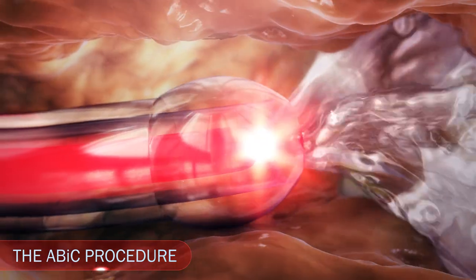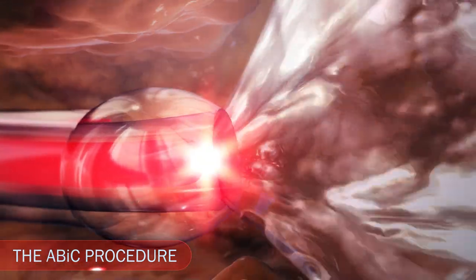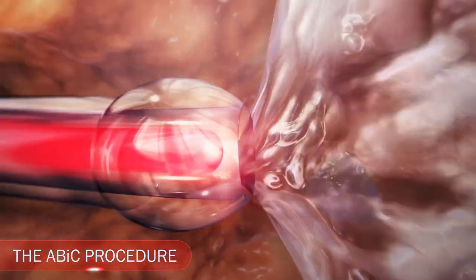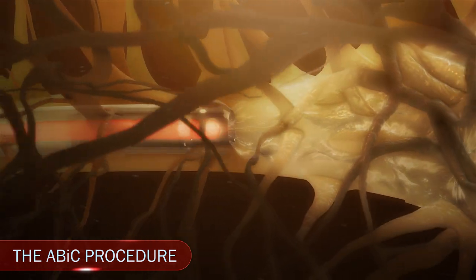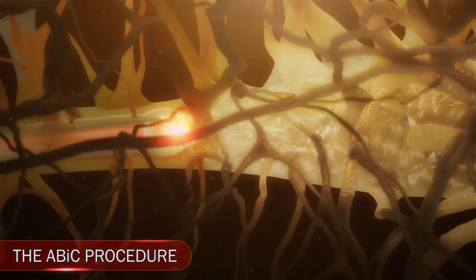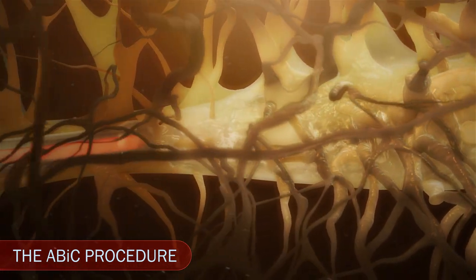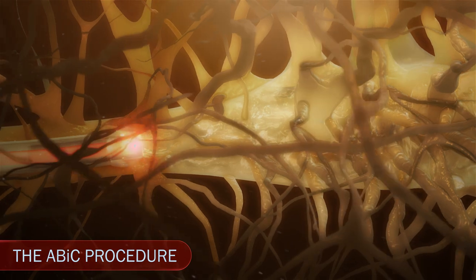Enlarging and flushing through the drainage canal and adjacent outflow channels helps the aqueous fluid to drain properly. The iTrack microcatheter is then withdrawn from the eye.